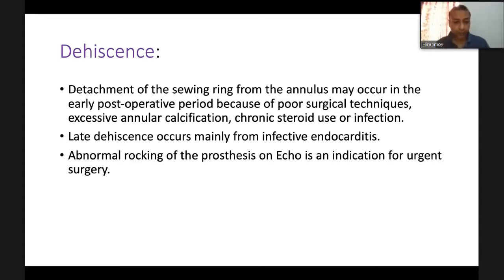Abnormal rocking movement of the prosthesis is an indication for urgent surgery. So if the base of the valve is moving abnormally, with rocking movement, that suggests that the valve is dehiscent.